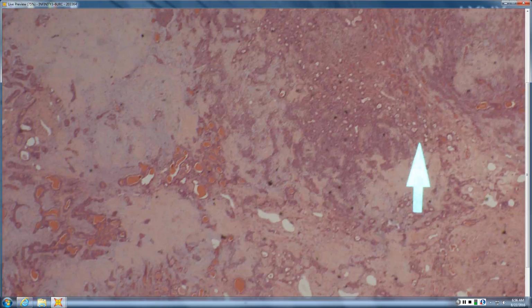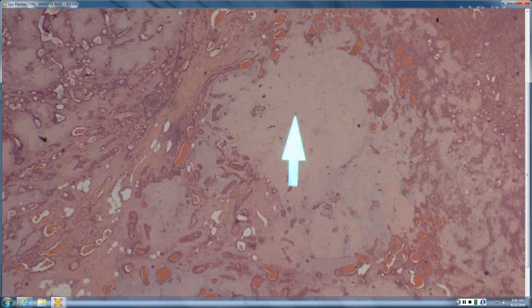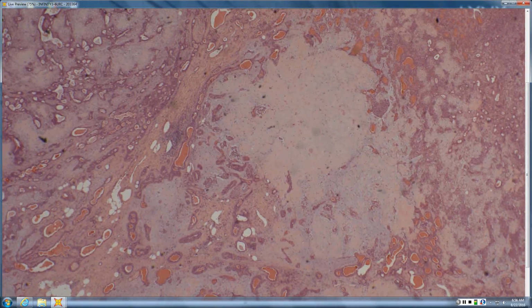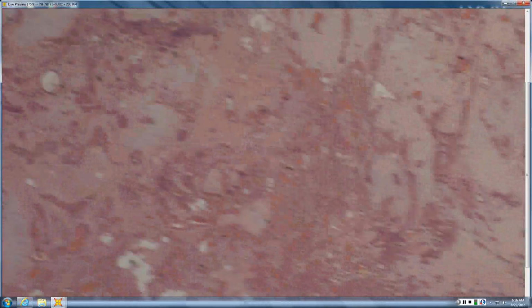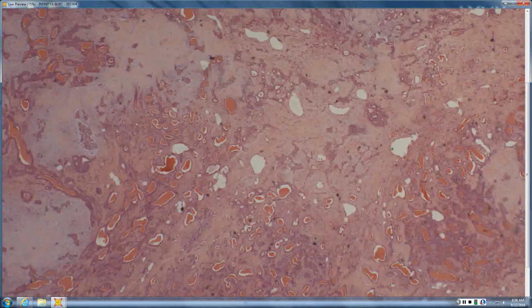Once again, from scan, you see that bluish appearance, and it looks like cartilage. But then you've got these branching alveolar space-looking syringomatous proliferations. Generally speaking, it's still well-defined. There are no areas of marked necrosis or atypia, so it doesn't look like it's gone bad or anything. So it's just a branching alveolar type of mixed tumor. I won't belabor that.